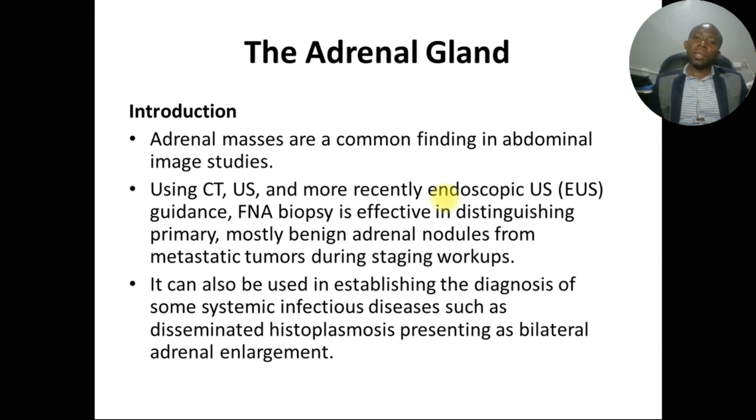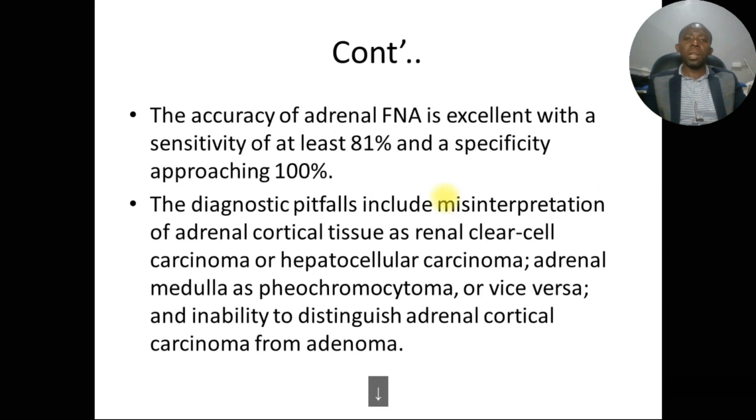Fine needle biopsy is very effective in distinguishing primary and mostly benign adrenal nodules from metastatic tumors during staging workups. It can also be used in establishing the diagnosis of some systemic infectious diseases such as disseminated histoplasmosis presenting as bilateral adrenal enlargement. This should not be mistaken, and when carrying out this diagnosis, we have to take keen interest in other different morphological features so that we can make a conclusive diagnosis.